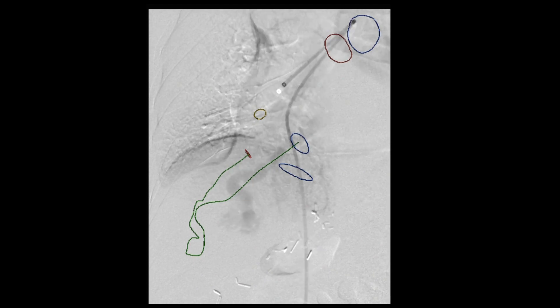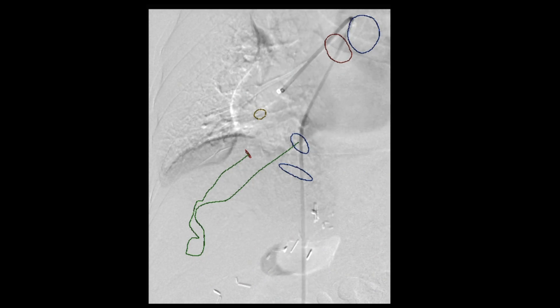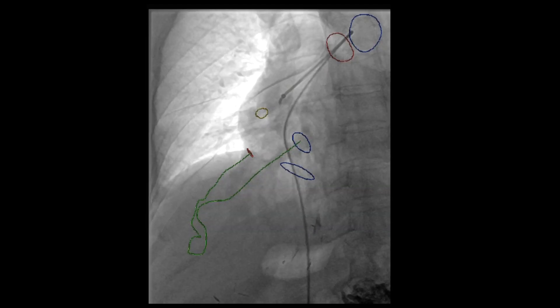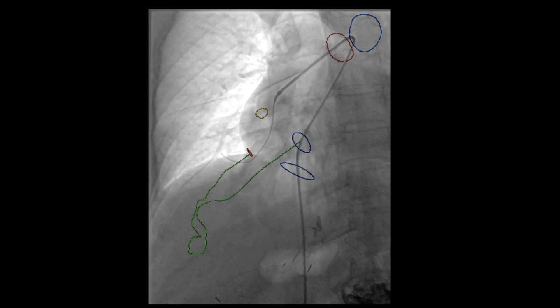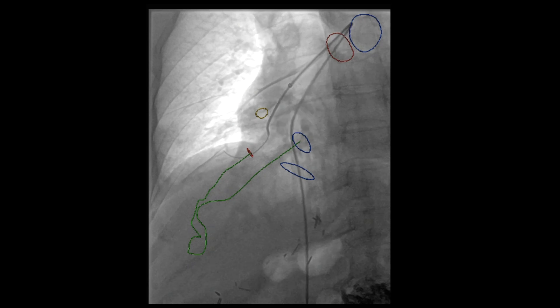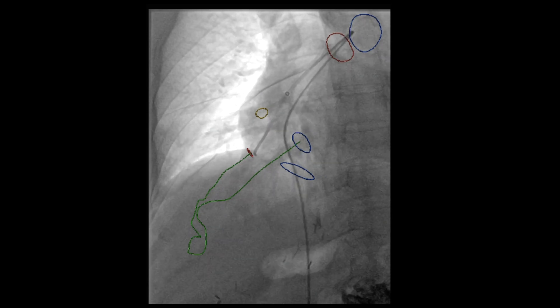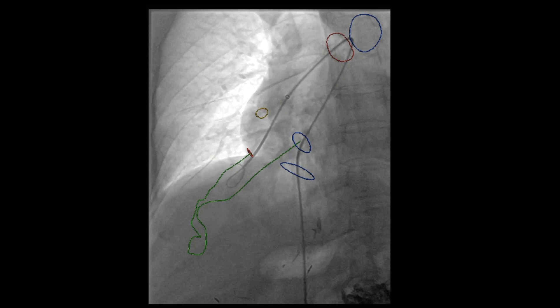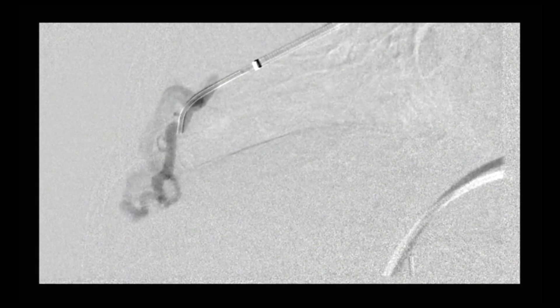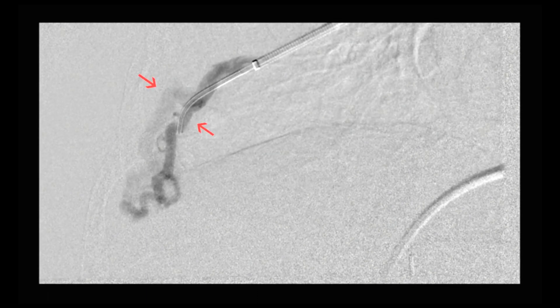A pulmonary angiogram is then performed through this sheath, better delineating the anatomy of this pulmonary arteriovenous malformation. A guiding catheter is then introduced and a glide wire is used to selectively cannulate the feeding artery. The wire is advanced followed by advancement of the catheter into the feeding pulmonary artery, and once selectively catheterized, a repeat angiogram is performed to better delineate the anatomy. This angiogram revealed two main arteries feeding into this pulmonary AVM, marked with red arrows on the screen.